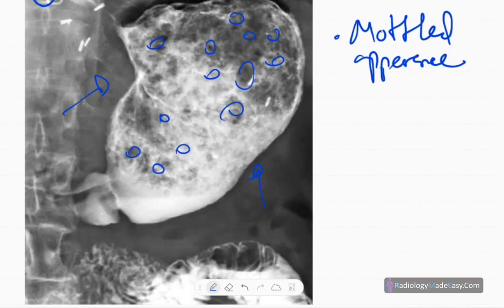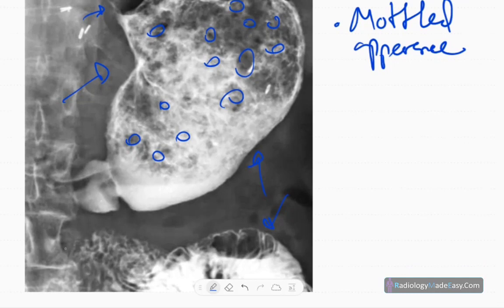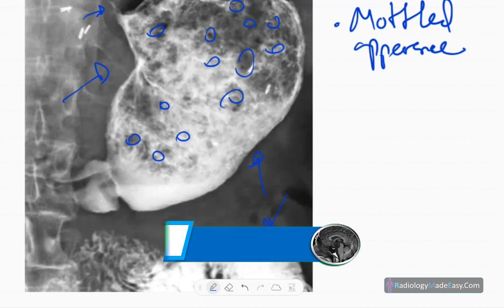However, the gastroesophageal junction is at the normal position and DJ flexure is at the normal position. You can see the passage of contrast to the duodenum and the upper jejunum, so there's no obstruction or obstructive lesions in this one.